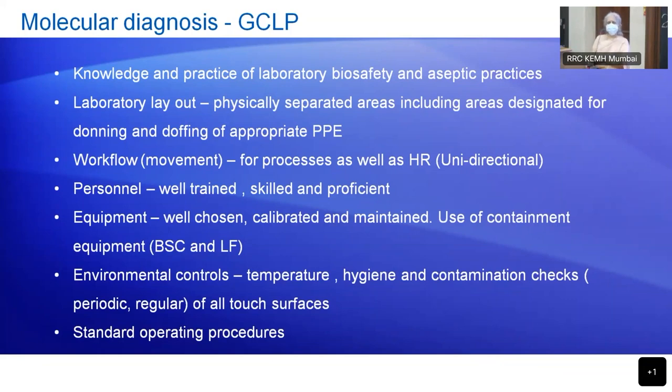So what will you do to find out if amplicon is present or not? Anybody who's working in the lab? Madam? Anybody?